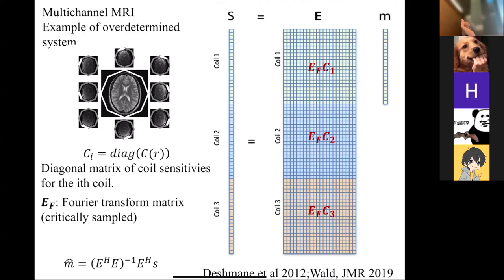If I put a coil here, it's going to be sensitive to the spins close to it, and then there's going to be a drop off. Typically, the rule of thumb is whatever the radius of the coil is, it's sensitive to things to a depth of that sort of diameter or radius, on that order. It's not to say that it doesn't see other spins, but it's mostly sensitive to that region, proportional to its diameter.